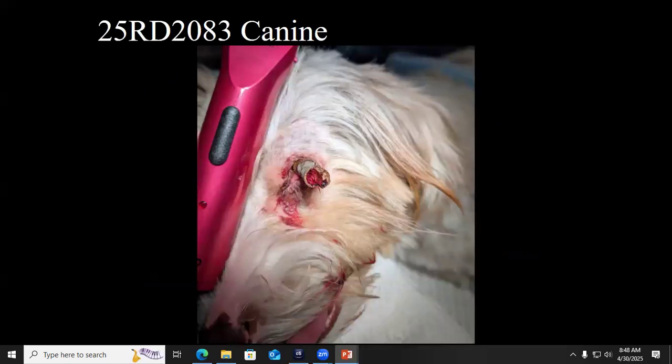So this is a 1-year-old mixed breed male intact dog. And if you haven't figured it out, here's our nose, here's our mouth. Here is a pair of clippers here for, I guess, size measurement. I guess they didn't have a banana maybe, or a cucumber for reference. It's an internet thing.